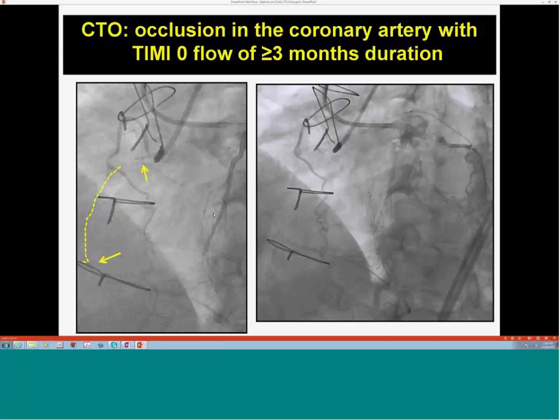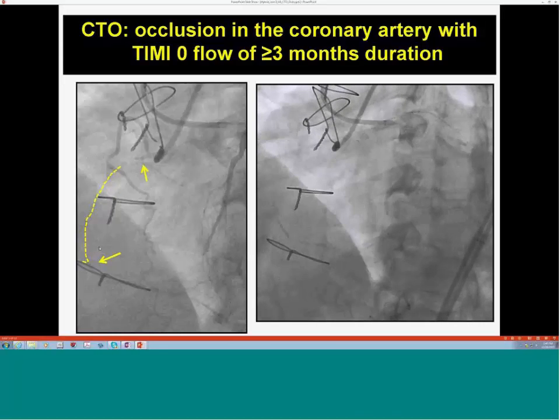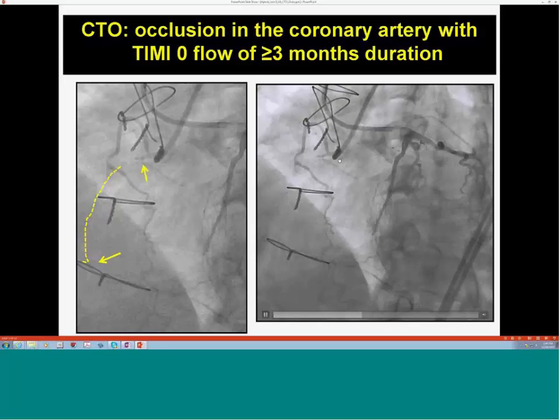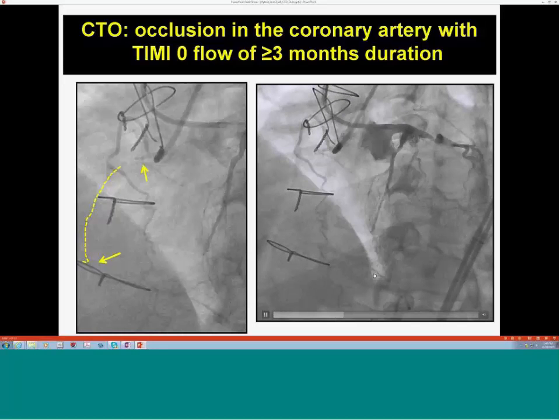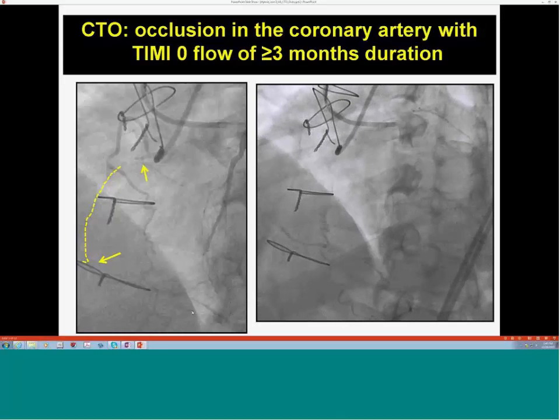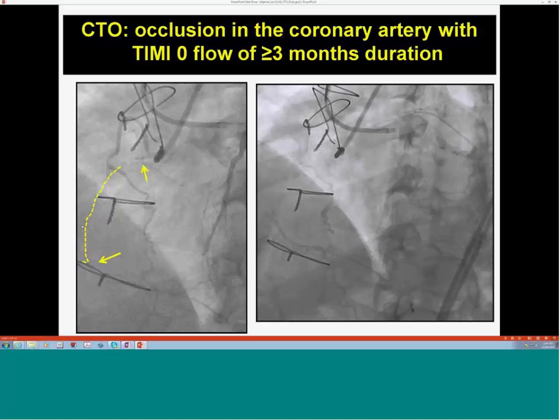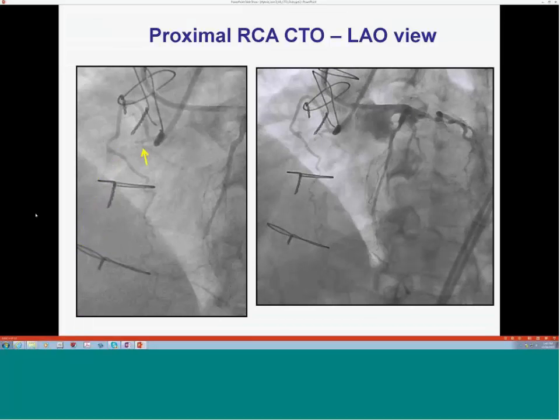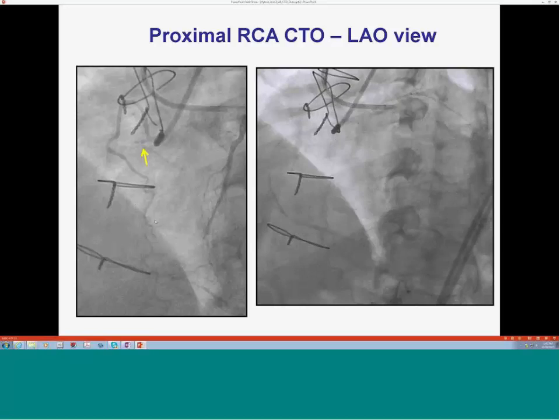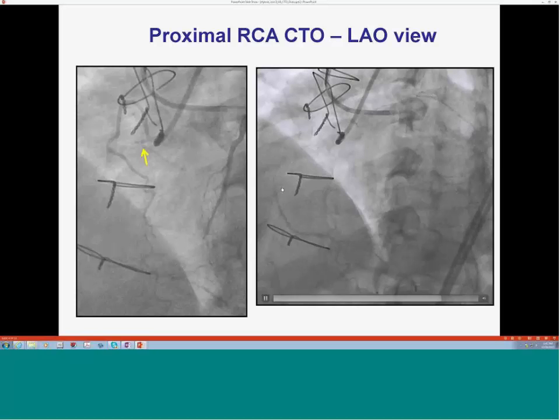Okay, so I don't know if you can see it now. So this is another case, again, a right coronary CTO. About 50% of our CTOs are right coronary, 50-60%. And this is one of those classic cases, proximal RCA, filling retrograde from the LAD, and then we have an occlusion that's probably from the proximal to the mid segment of the right coronary. It comes back quite a bit. And again, a similar view. You see the stump coming way back, but still it's at least 40-50 millimeters of occlusion.